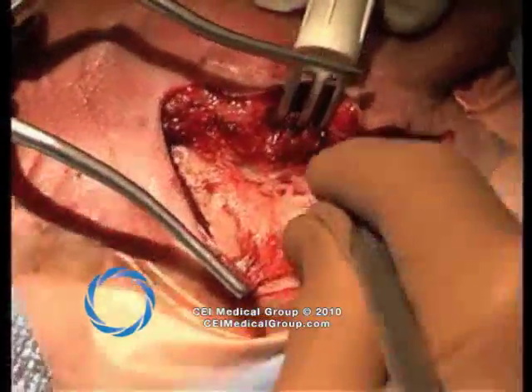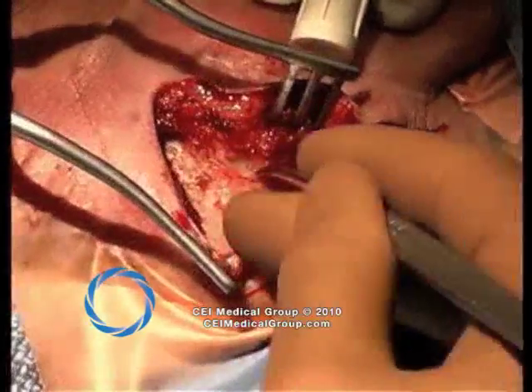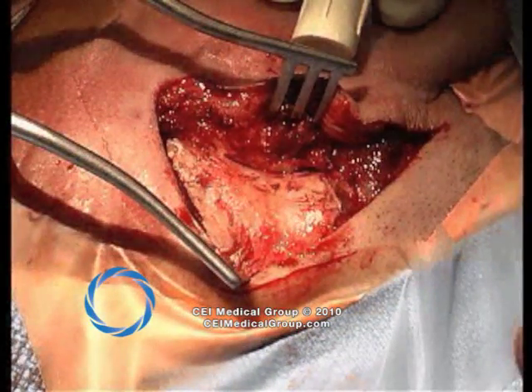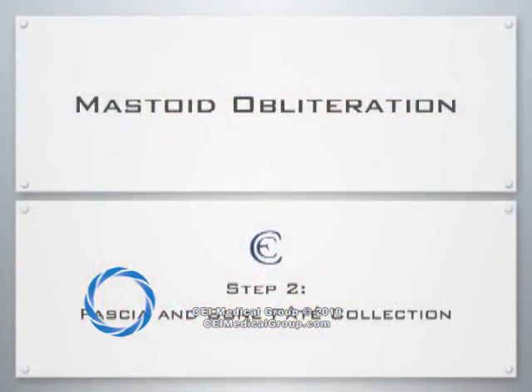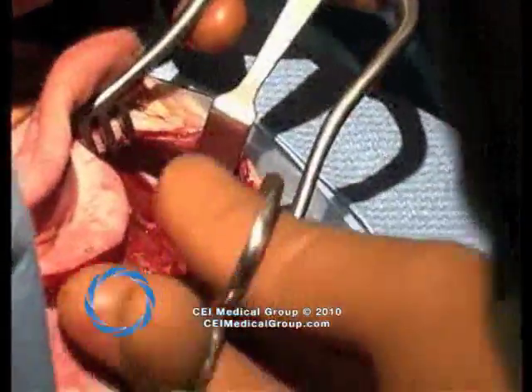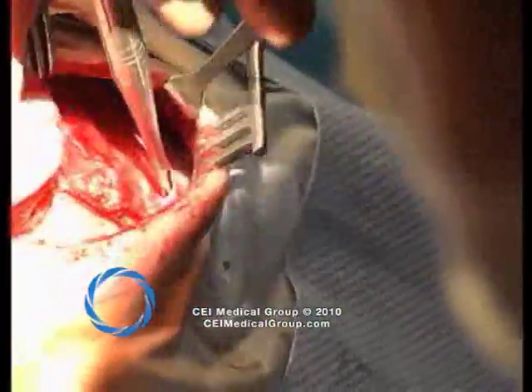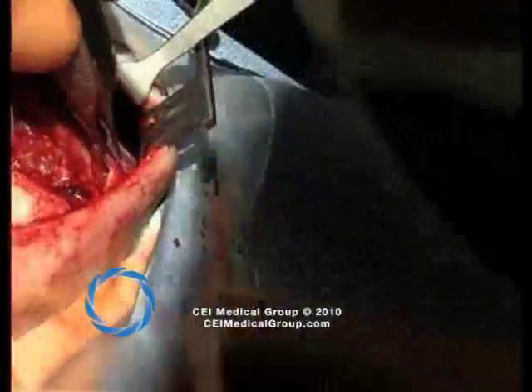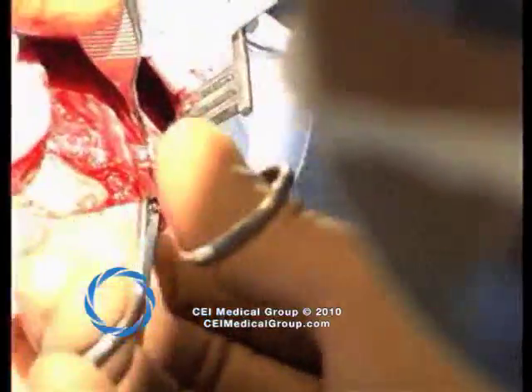Every attempt is made not to penetrate the skin of the bowl itself. The two building blocks of reconstruction are then harvested. The first is fascia, and in this example you can see where the previous surgeons harvested fascia at the inferior margin of the temporalis muscle. More superiorly, aided with a small retractor, it is possible and necessary to harvest a very large piece of fascia.